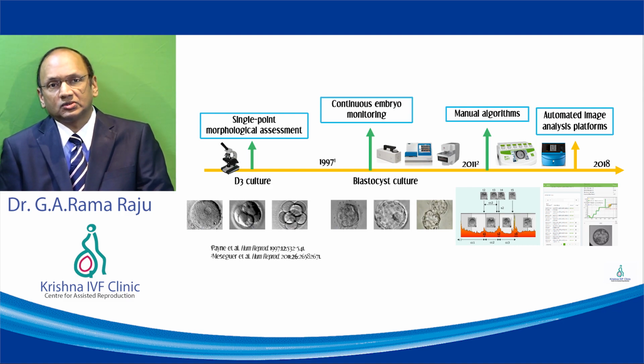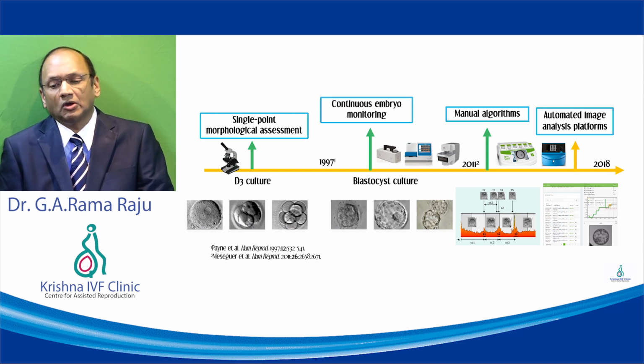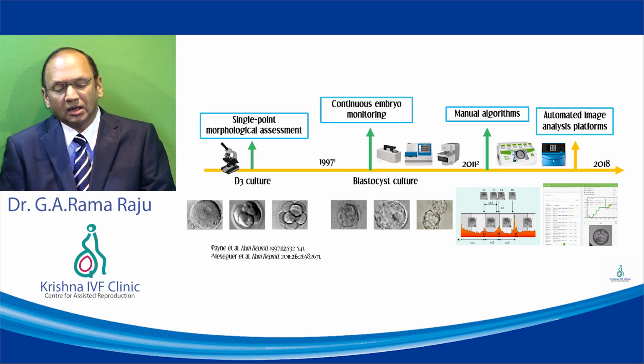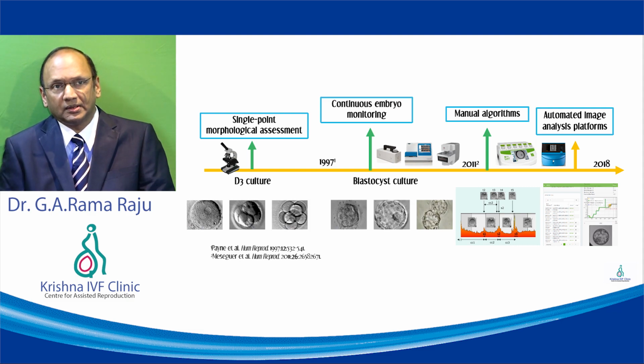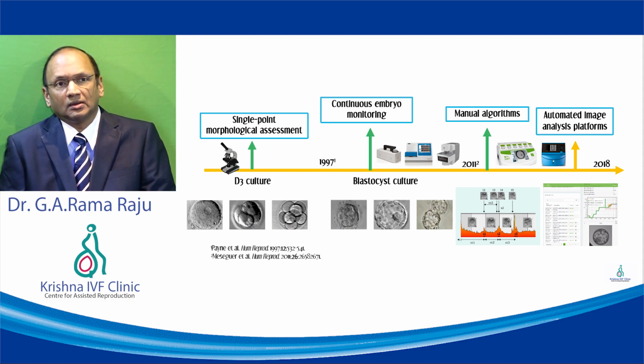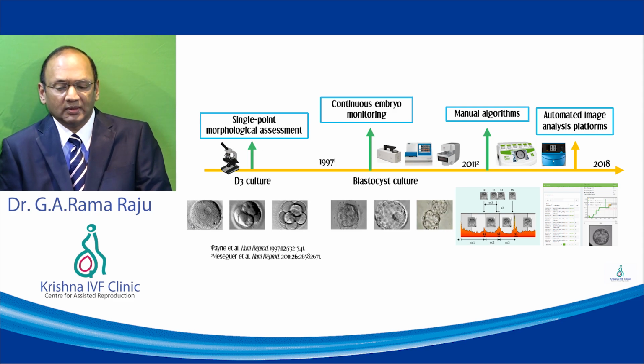Since 2018, these algorithms have become automated, and the equipment has undergone further refinement. So in time-lapse you have three phases: first, the crude equipment of the microscope kept in the incubator; then continuous monitoring with a manual algorithm; and now the automatic algorithm, which is making a difference.